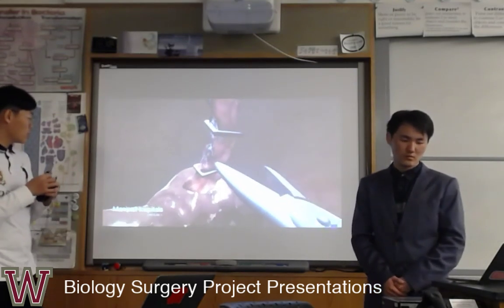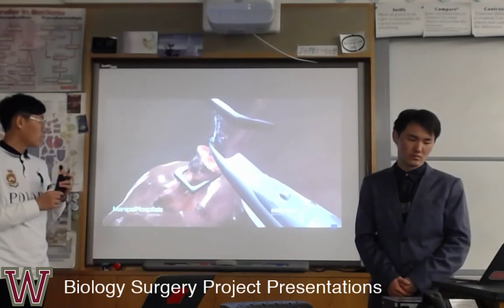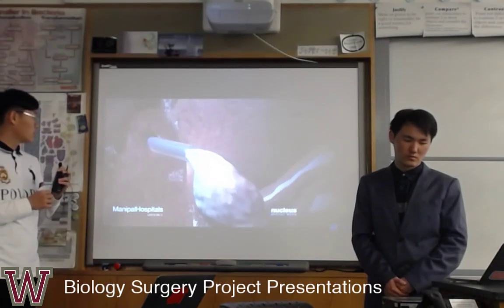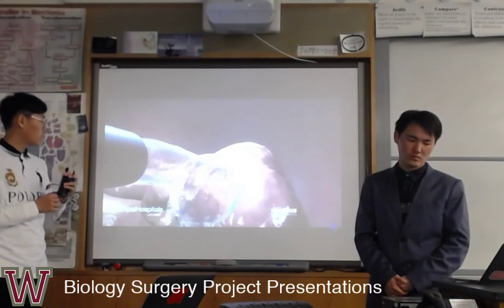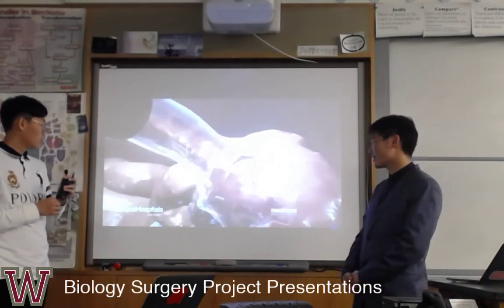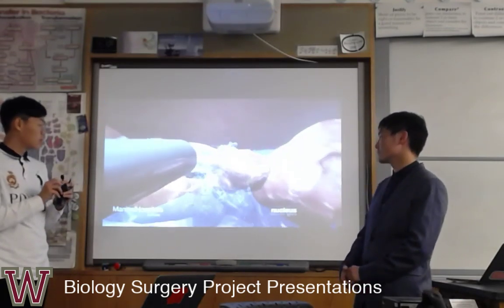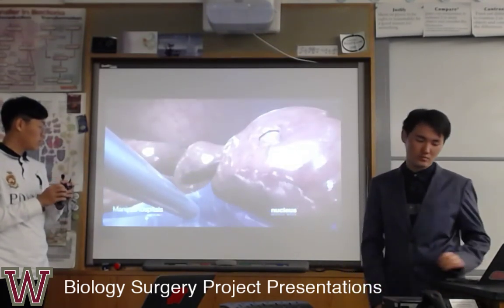Then we take out the appendix and remove it through one of the ports. Last, we clean it with a special liquid to make sure it was all clean inside the stomach and the end of the cecum. Yeah, that's it.